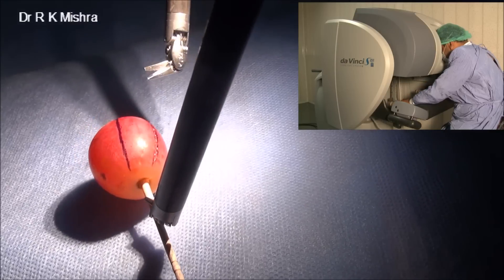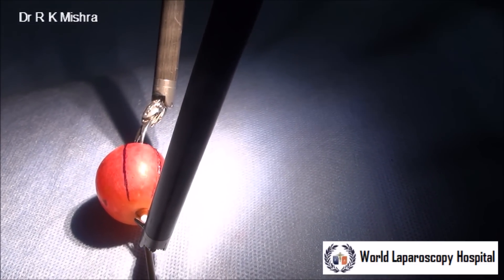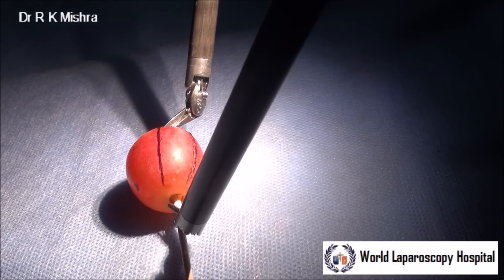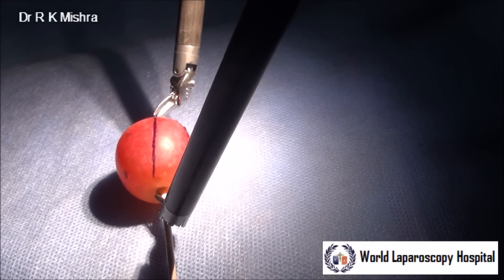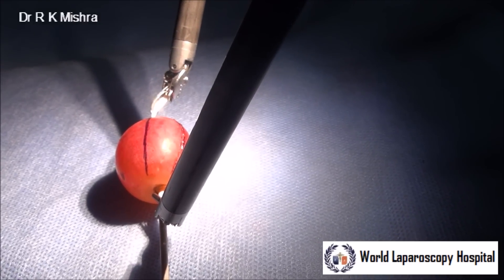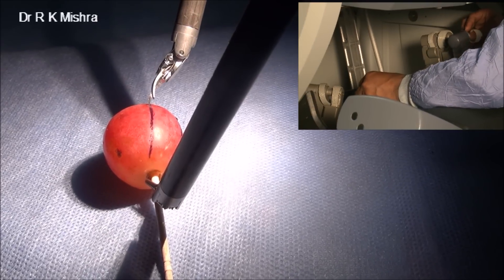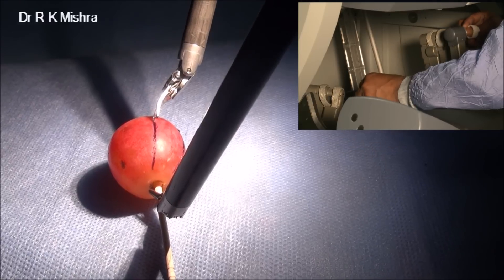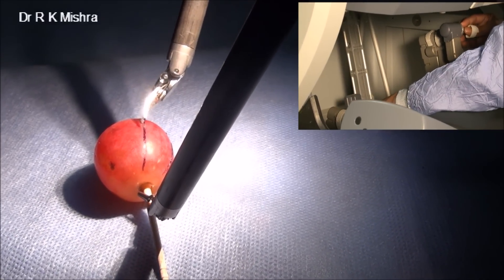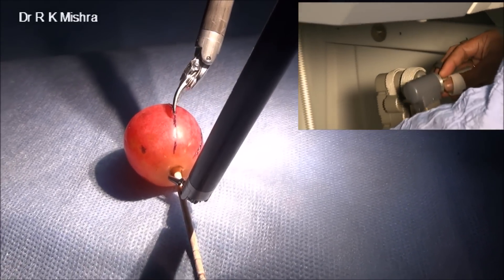Of course you need to have a very good hand to do that, but slowly, once you keep on practicing for many days, you can make the line as sharp as a knife. It is impossible to cut with that precision even with open surgery. If you take open scissors, it is not possible. But with the Da Vinci robot, if you stabilize it and slowly keep on cutting along these lines and keep on practicing for many days, you can achieve this skill.